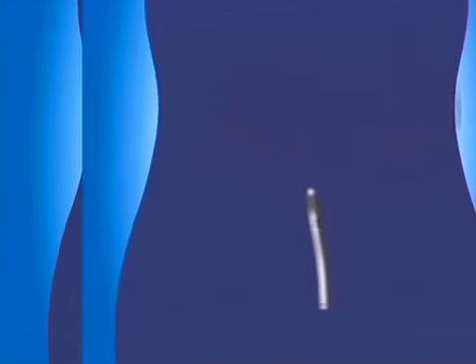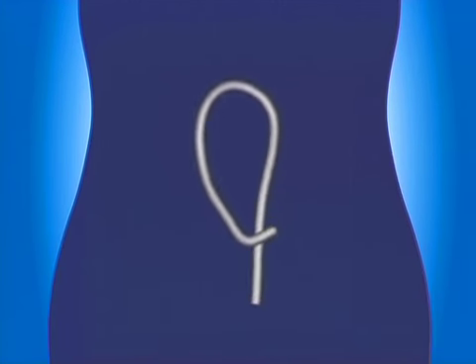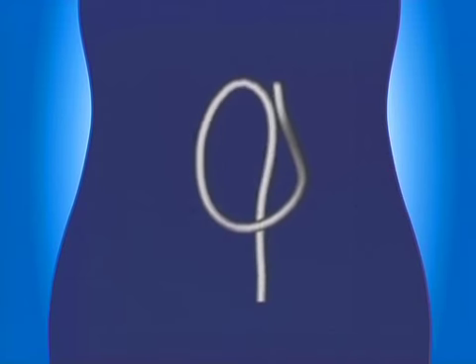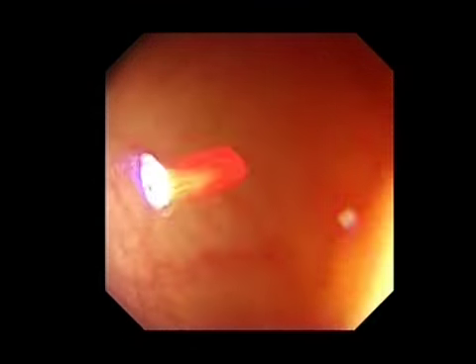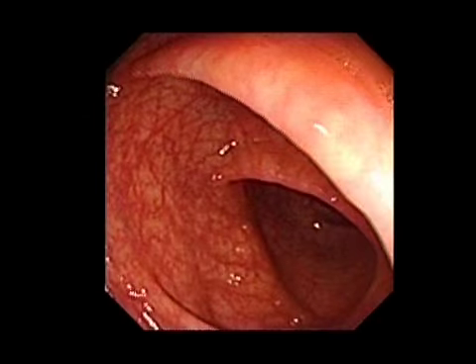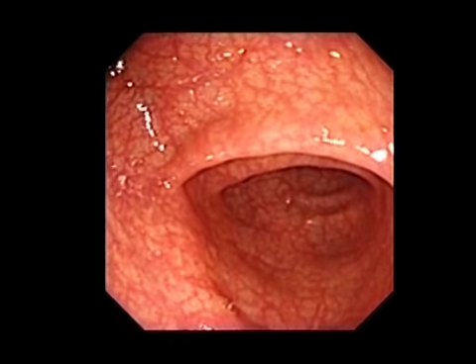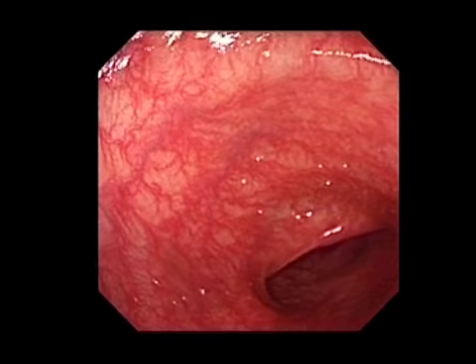Let's look now at some of these sigmoid loops as recorded on the 3D imager. This is an N or spiral loop. See how mobile the sigmoid can be. Here's an alpha loop forming, and now the loop is being straightened by pull back and clockwise torque. Steering carefully and handling the scope properly, tracking through the sigmoid should usually take little time and present no great problem. However, the sigmoid is the most unpredictable part of the colon.